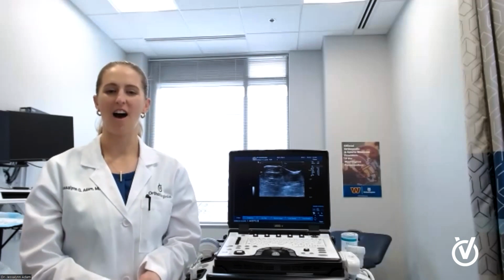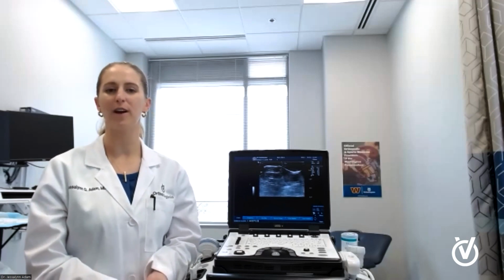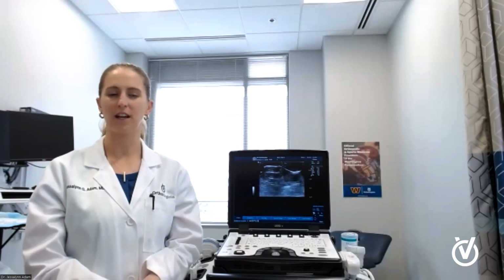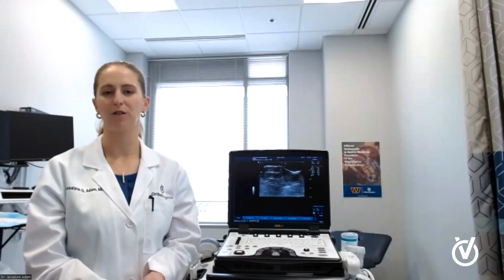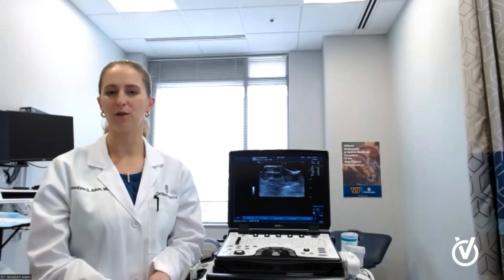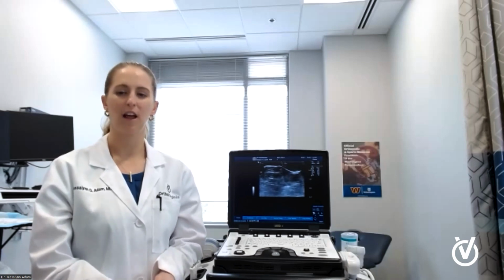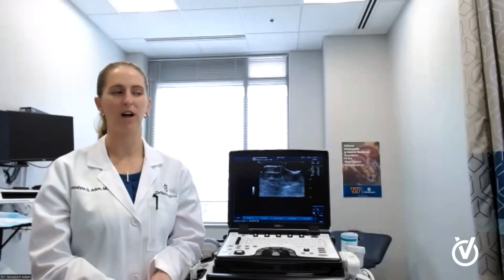Thank you. Can you diagnose pain around knee and hip replacements with an ultrasound? It depends. So ultrasound can be part of that workup. Often there are many tests that may need to be ordered to thoroughly evaluate that problem. But certainly if there's any concern for a fluid collection, then ultrasound can be helpful to look at that, or if there's concern for a muscle tear. If it's something having to do with the hardware or inside the joints, then often you do need some other tests, perhaps some blood work, or sometimes even an MRI as well.